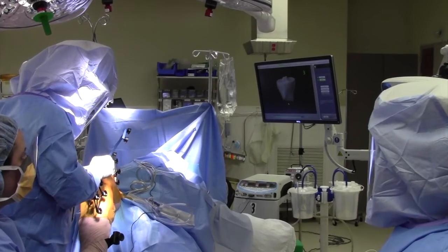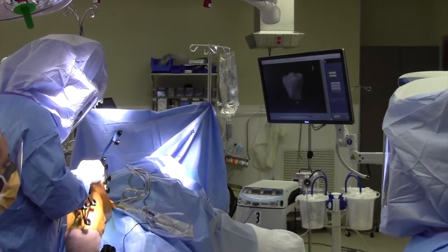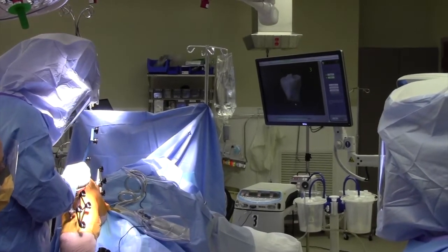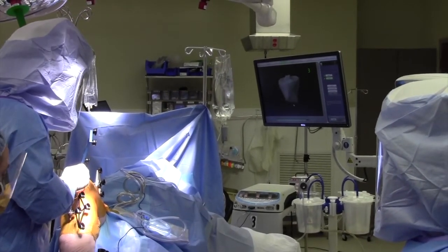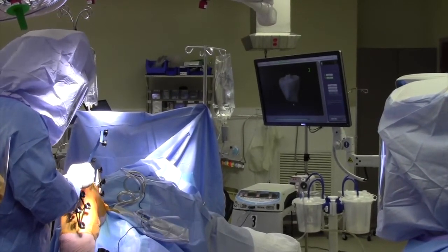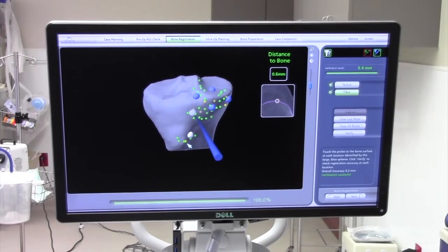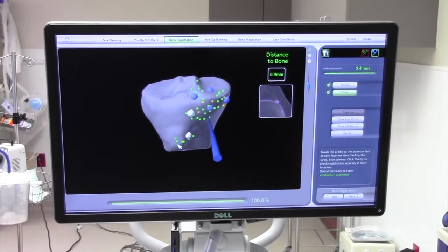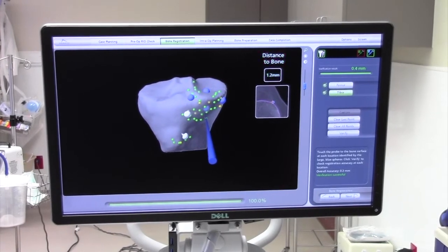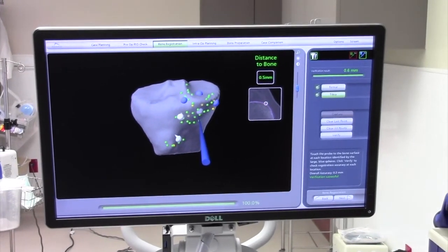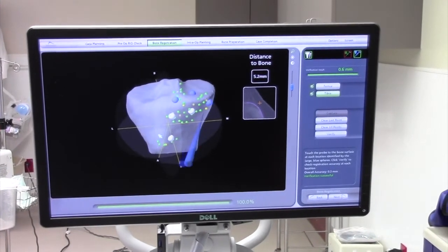In the OR, the first thing we're going to do is tell the computer where the knee is in space by registering 50 to 60 points on the tibia and femur, as you can see here.